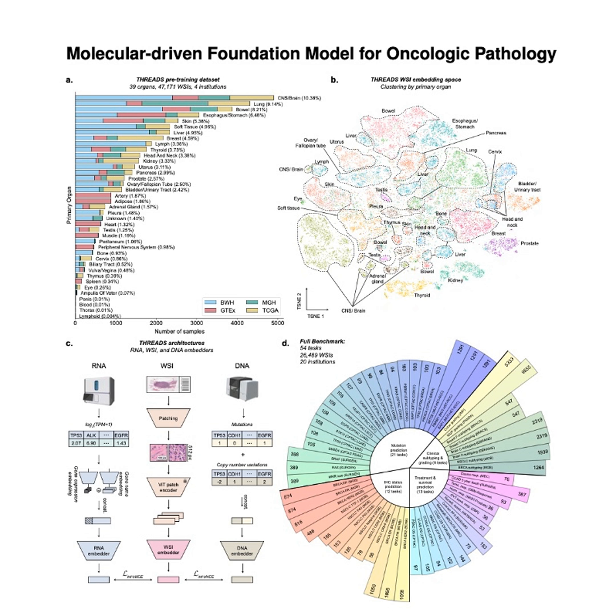Exactly. And that molecular pairing acts as a sort of unbiased guide that the model desperately needs when learning from the images. Let's dig into that guidance mechanism, because traditionally, AI models in pathology often tried to learn based on what pathologists wrote in reports, or just based on visual similarity alone. Why is it so critical here to ignore that subjective layer and bring in the raw molecular data, the DNA and RNA profiles?